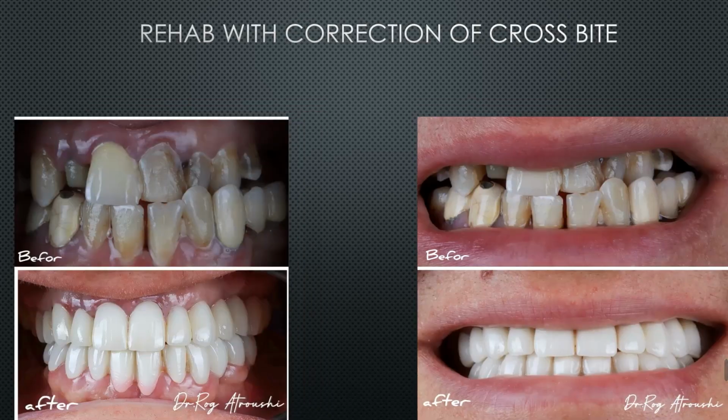This case was a massive case with a severe crossbite here. This is impossible to do with classical dentistry, dear colleagues. So we did what we do in the other cases, which is increasing vertical dimension, opening the bite, and we could prepare this a little more to the inside. I didn't prepare from here, to restore it to normal occlusion. Of course, we have some minor issue with the midline, but the case isn't a cosmetic case, it's a pathological case.